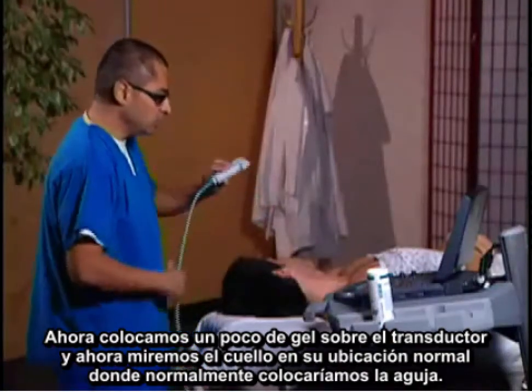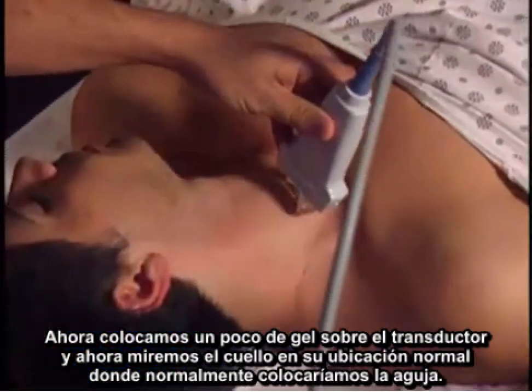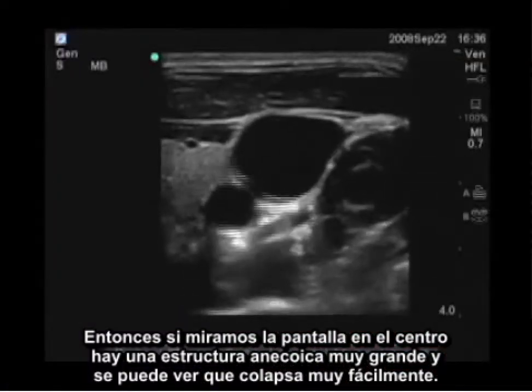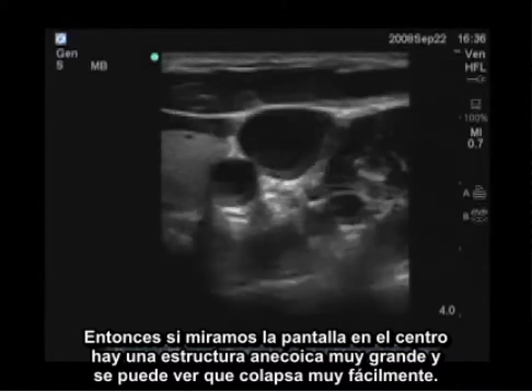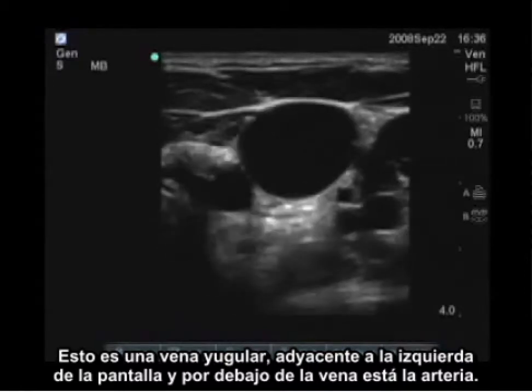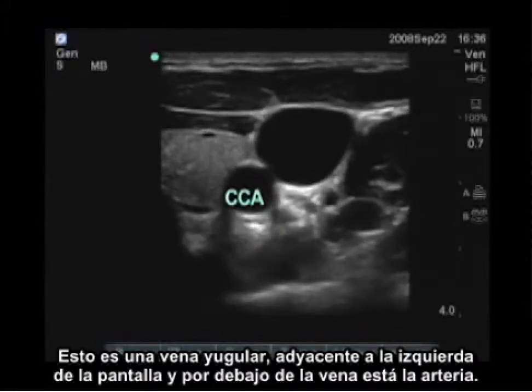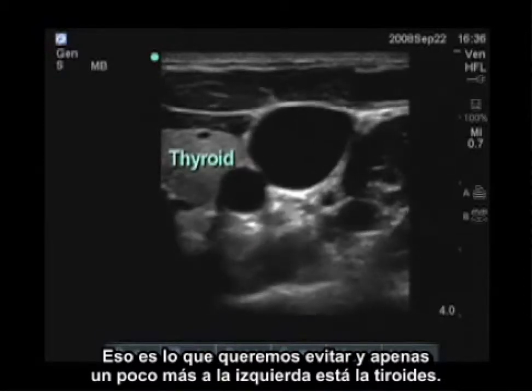And now let's take a look at his neck in the normal place that we would normally have put our needle. So if we're looking at the screen, in the center of the screen is a very large anechoic structure, and you can see that it easily collapses. This is the jugular vein. Just adjacent to this, to the left of the screen and below the vein, is the artery. That is what we want to avoid. And just a little bit more to the left of that is the thyroid.